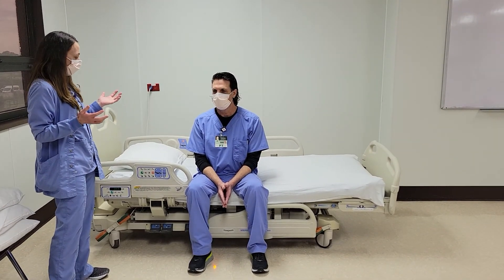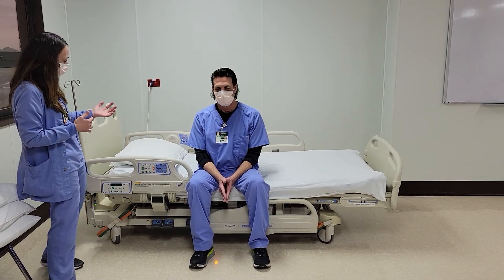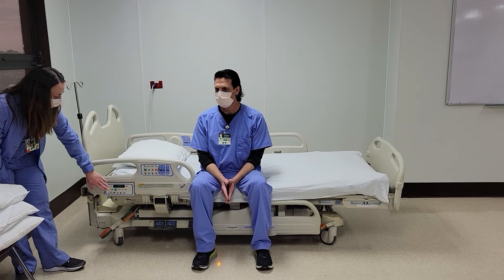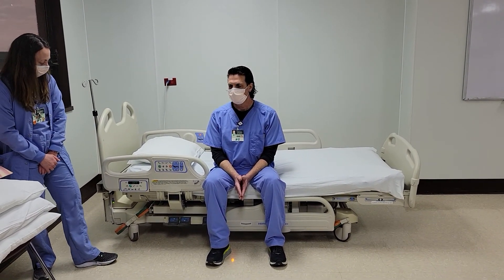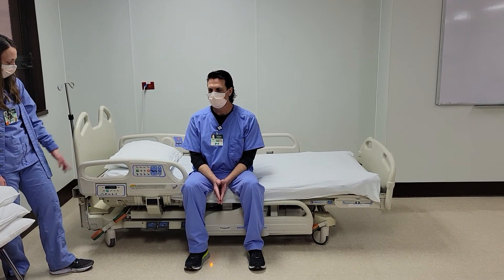A couple things to review that everyone's probably familiar with: our bed controls. In this section here you have your turn assist, your bed scale, and your bed alarm. Most of you are familiar with this — you have to utilize the key button to access these functions.